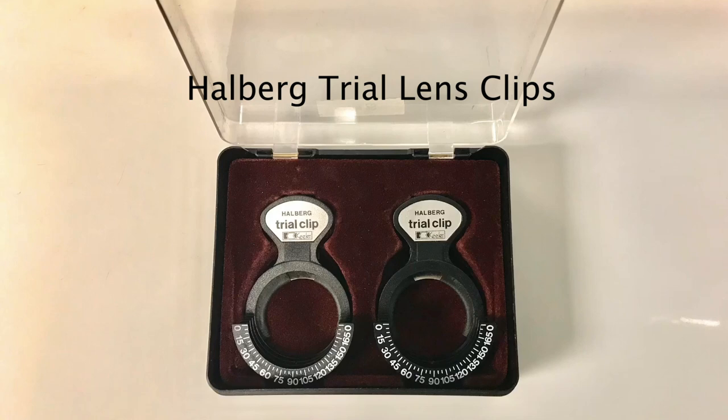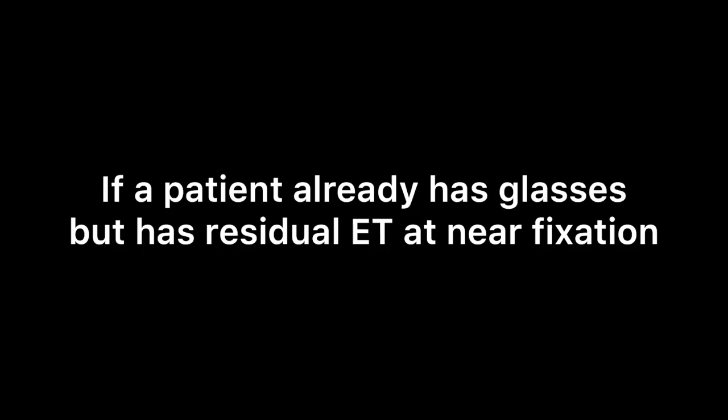Halberg trial lens clips can be helpful when trying to determine if a patient needs more plus or would benefit from a bifocal. These are used to place additional plus lenses over a patient's existing glasses. You then repeat their near measurements and see if it improves with the plus lens. If it does, then they may be a good candidate for a bifocal.